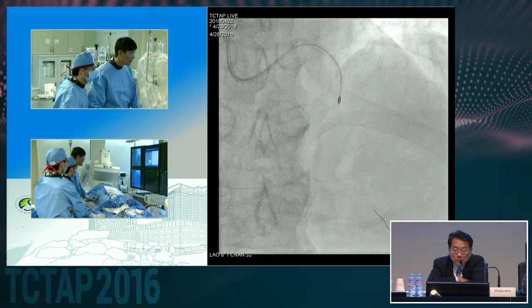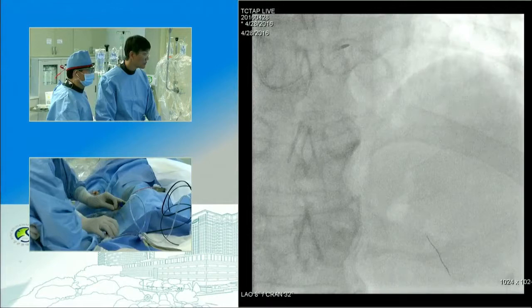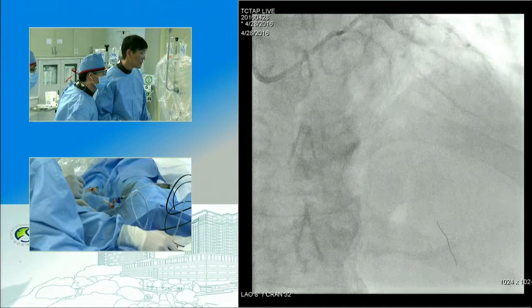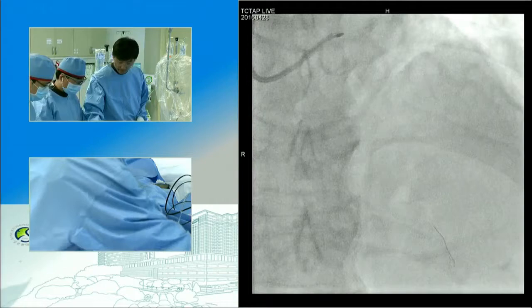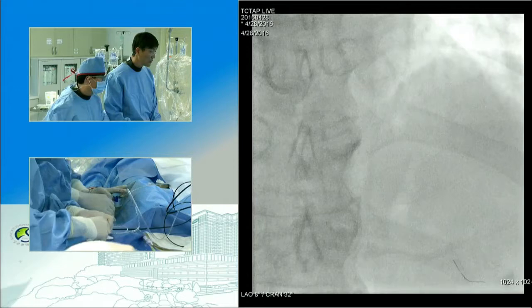Yeah, we got the angio, fluoro, polish run. Okay, and the fluoro test. Okay, we didn't lose the diagonal. So I'd like to check the IVUS first, then I will decide whether we need to upsize the burr or not. Okay? Dynaglide, and okay.